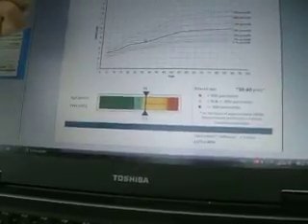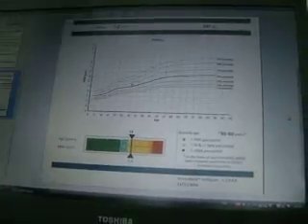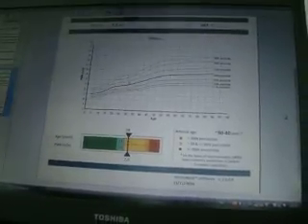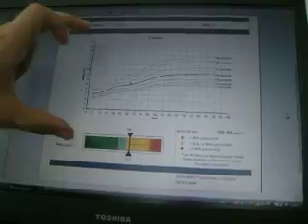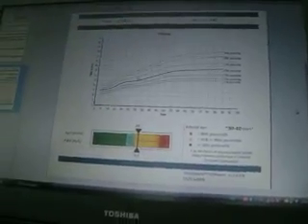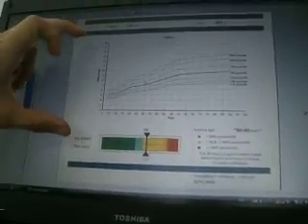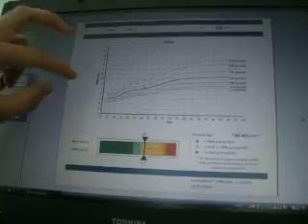This is a calculated pulse wave velocity and the return time. Of course, pulse wave velocity is calculated from the return time. As very good feedback to the user and to the patient, we give the age-related pulse wave velocity value.